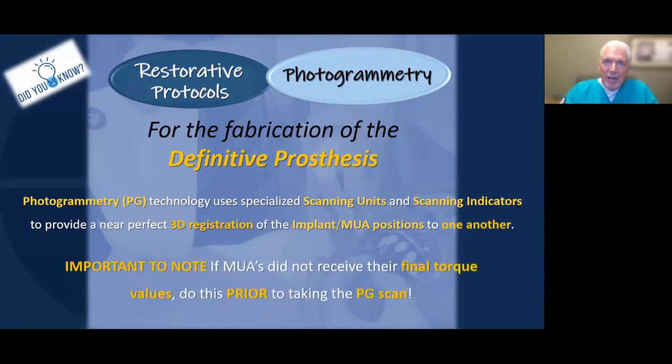So, we still need to keep in mind, this is something I think a lot of people miss, especially if you're in a scenario of the restorative doctor where you've referred your patient to a specialist for the implant surgery. Sometimes at the time of surgery, when the clinician places the implants and the multi-unit abutments, they didn't get the best initial stability. They didn't maybe get their 30, 35 newtons of insertion torque, yet you're still comfortable with loading an implant at maybe even 15 or 20 newtons because it's in between other implants.